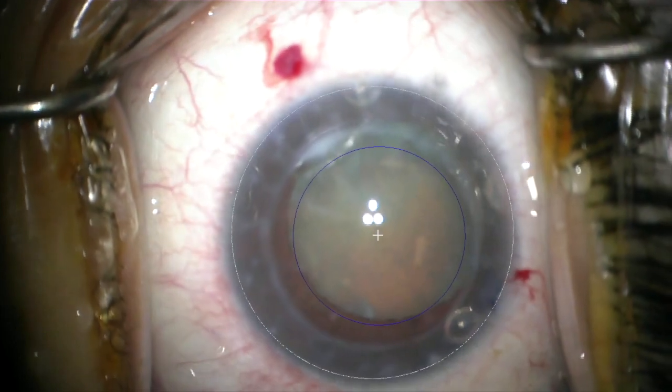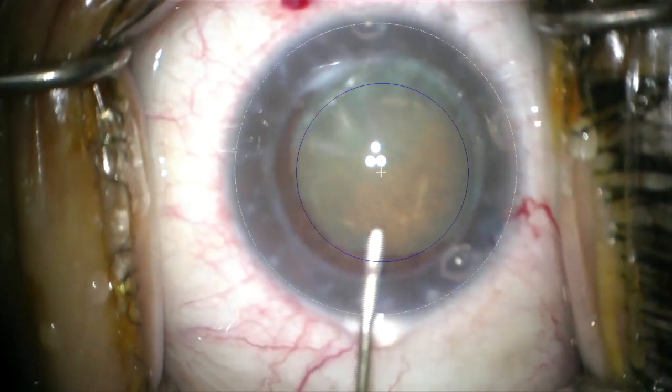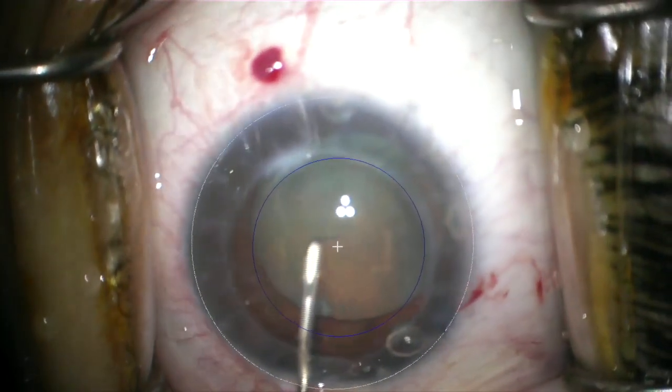Here I'm also using the Zeiss Lumera microscope with the Callisto system, and it's projecting the rhexis size of 5.2 millimeters. I find this also helps to aid in construction of my rhexis.